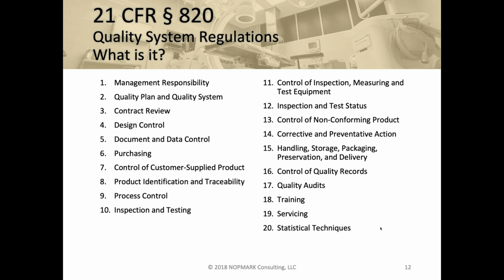For example, in number 18, if you're using some software to train your doctors, or you're using some software to train your service personnel, that software has to go through some type of software testing or qualification. If you're using software to manage customer complaints, that software also goes through some software testing. So within the medical device world, it's not just the software that's the main product, but software that's used in any of these 20 areas also falls under the regulations in terms of how that software needs to be tested.